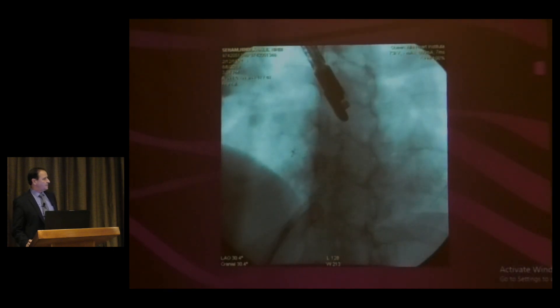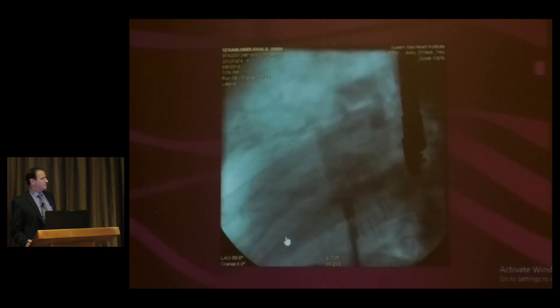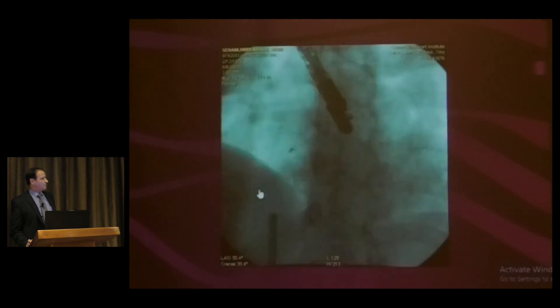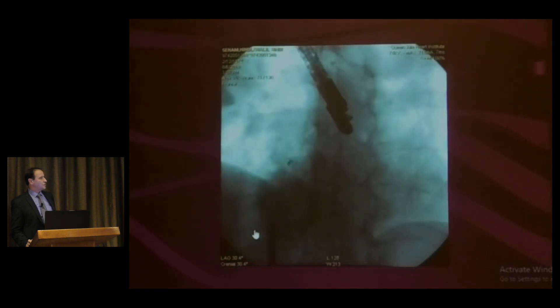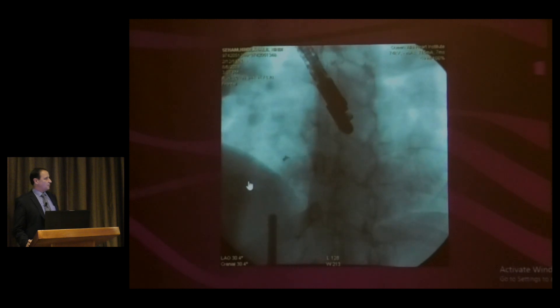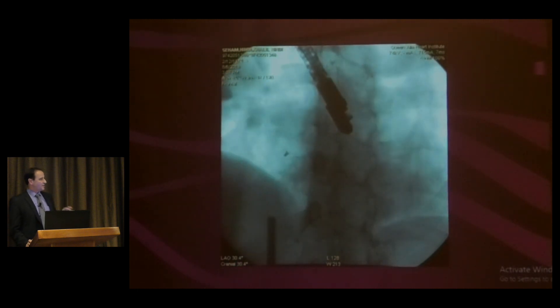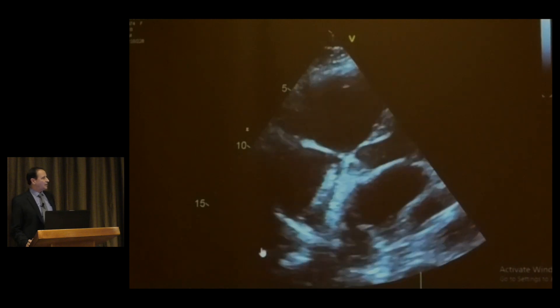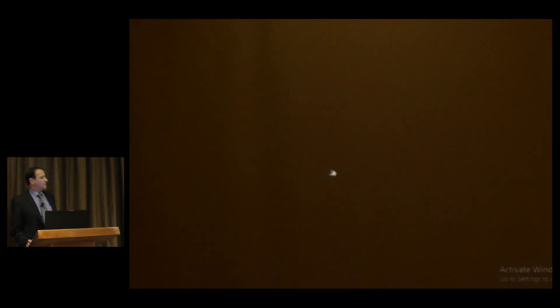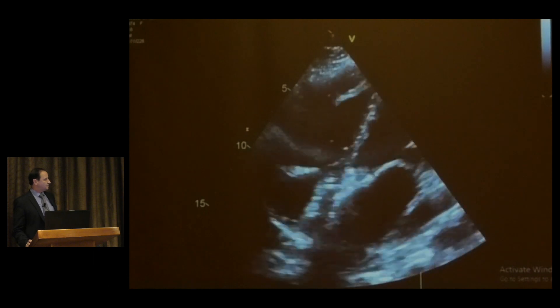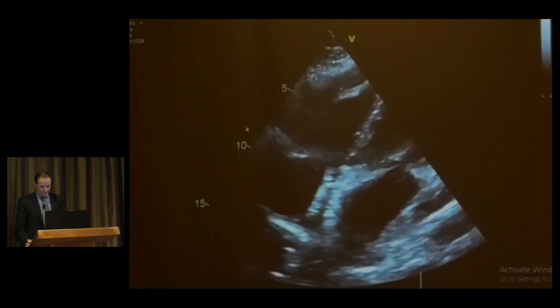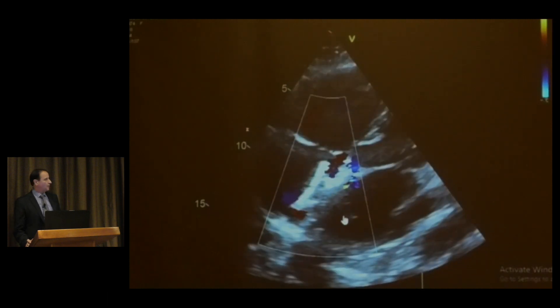We released the device and you can see it in position. After that, we performed an angiogram to check for contrast flow. The pulmonary artery angiography showed a very small shunt through the mesh. We then performed a TEE to confirm device position — it sits well, with good function and no pericardial effusion.